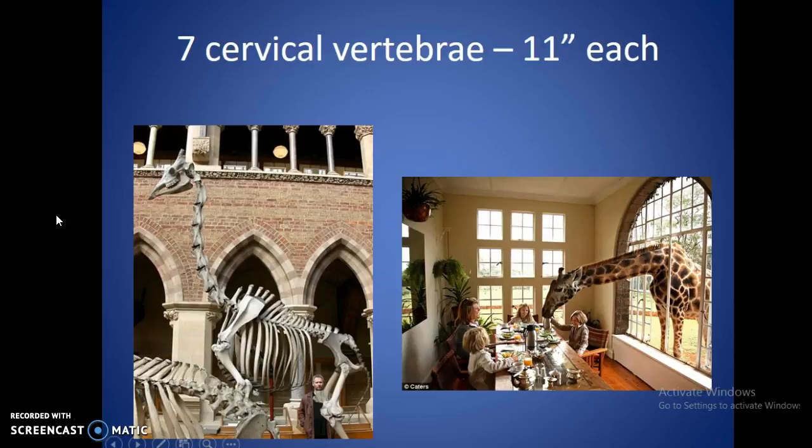So this concludes the cervical vertebra presentation. There are other views to cover, but we will be going over quite a bit in the laboratory. If you have questions about this or how your clinic may be doing AP obliques as opposed to PA obliques, we can certainly cover that as well within the labs.